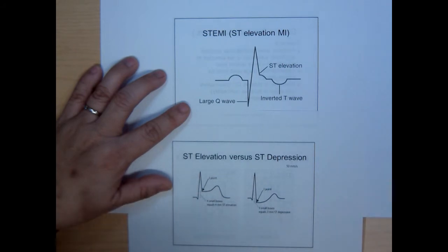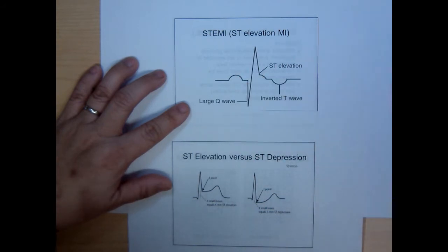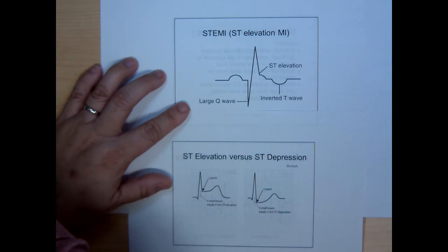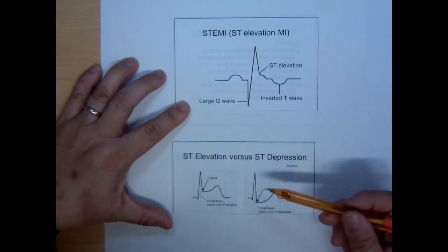The ST elevation is simply telling you the ventricles are trying to recover during the QRS and during the QT. So when you actually have a problem with perfusion, it's going to show up in the EKG waveform as an ST elevation MI when somebody's ruling in for an MI. Let me show you something else. They go by something called the J point.